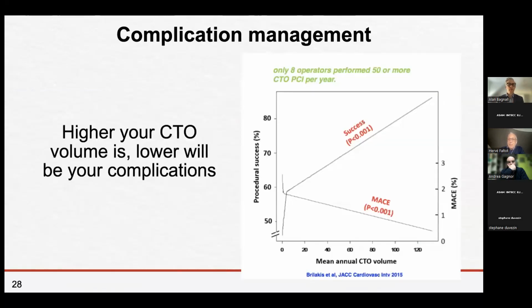I like this slide from Manos Brilakis, who said that the more CTO you do, the more success you will have and the fewer misses. I think it's very important to have that in your mind. So the higher your CTO volume, the lower your complications will be.